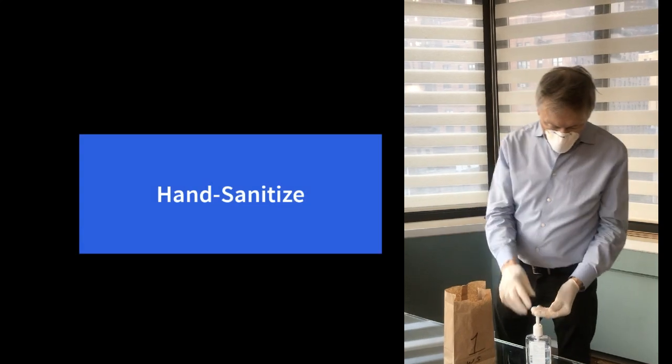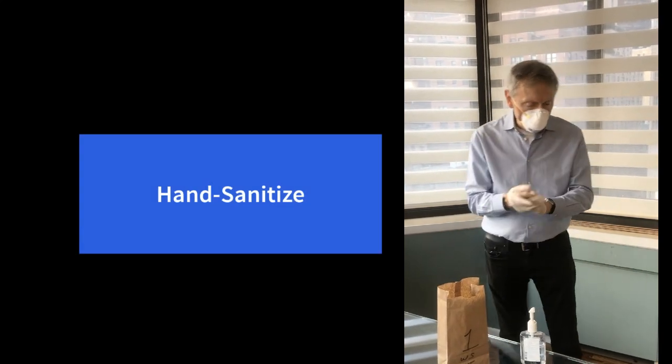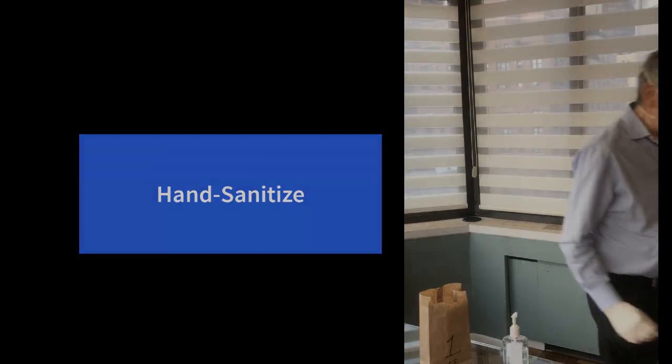This is called a positive fit check. Next, he's going to hand sanitize — again, a 20-second process — and then proceed to go to work.